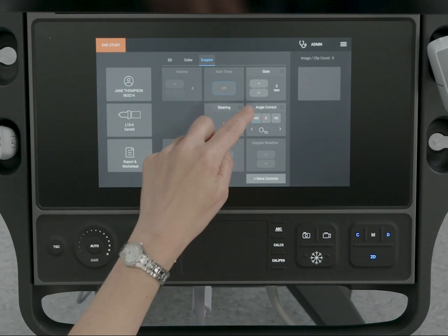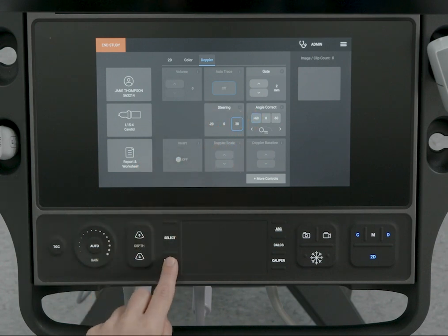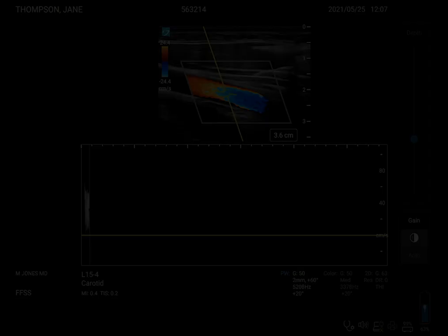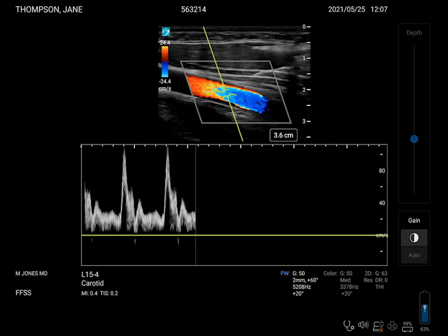You may need to tap the More Control button to find the control. Press the Update control to activate Doppler.